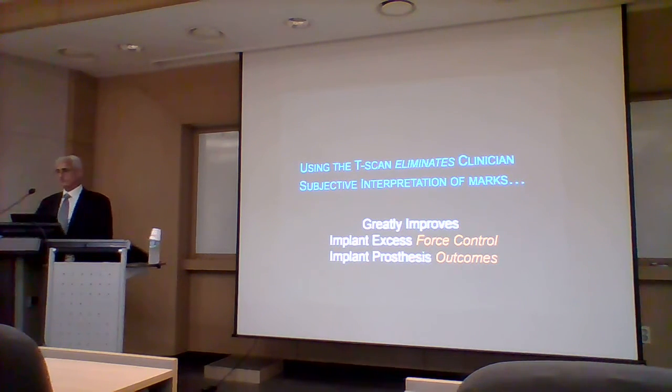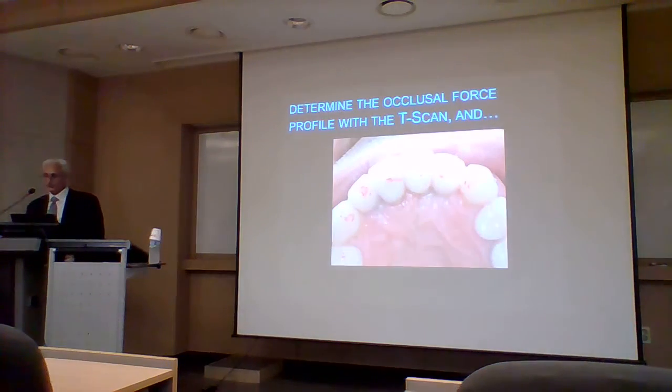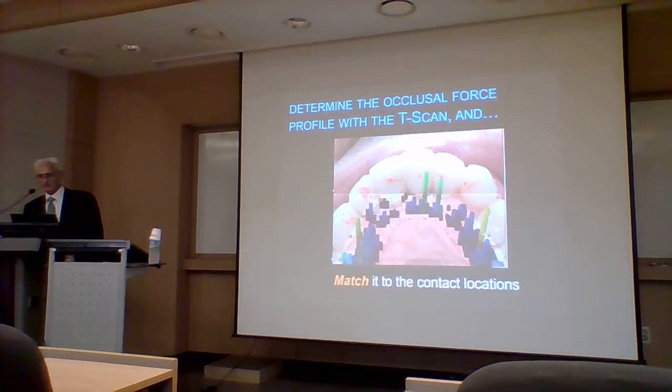결국은 우리가 보철을 하고 보철하는 것들이 교합에 대한 것들을 보는 거고, 교합에서 여러 가지 포스 같은 컨트롤하는 게 필요한데 그런 것도 컨트롤 안 됐을 때는 결국은 메커니컬 페일리어가 증가하는 것들을 피할 수 없다는 거죠. So what we do is we use the T-scan data to determine the force profile, and then we match it to the locations on the teeth so that we choose wisely which contacts to correct.